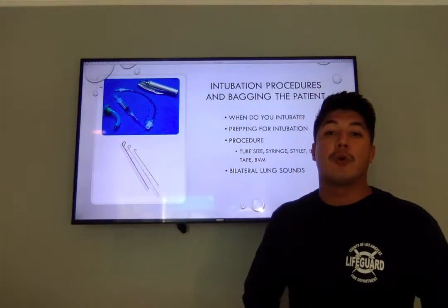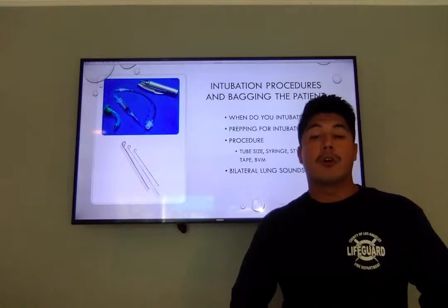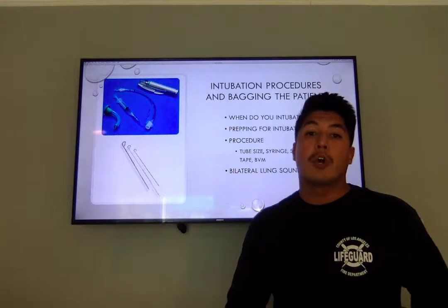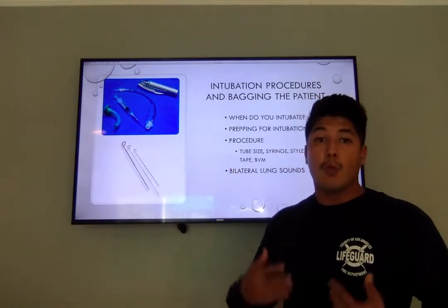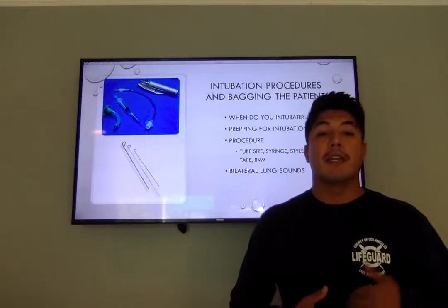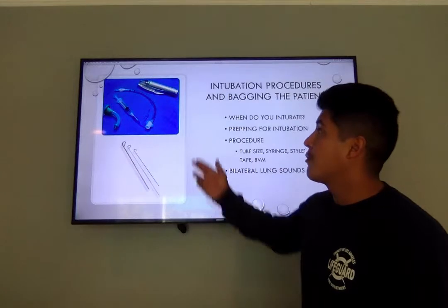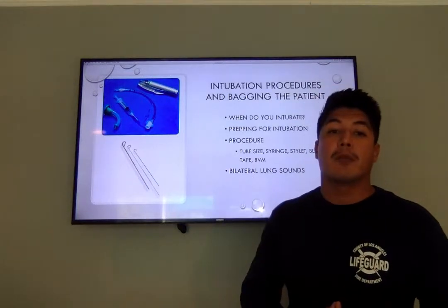They may do so when a patient is in cardiac arrest, respiratory arrest, traumatic arrest, drug overdose, persistent seizures, or respiratory failure. What we can do is we can clear the airway of any obstruction, so remove any emesis, any food, or any type of foreign body. Next, we can ask which French size or tube size the medic would like.